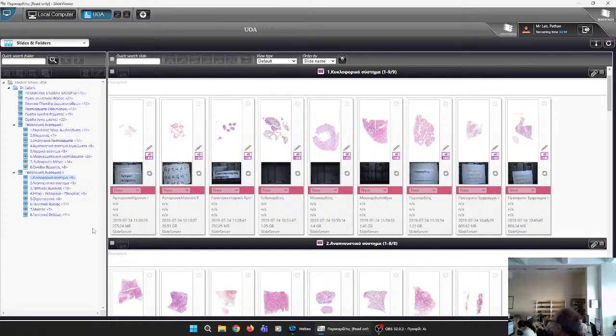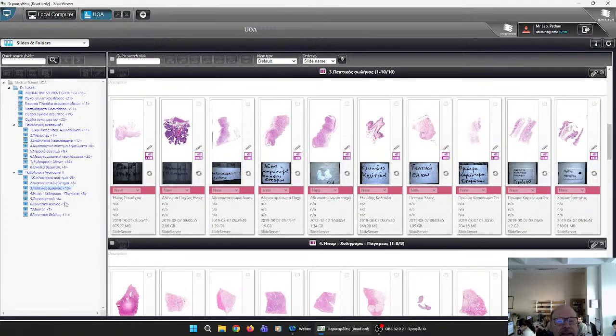Yeah. Okay, shall we pass now to the GI? Okay. Now we have the GI tract. Here we are.